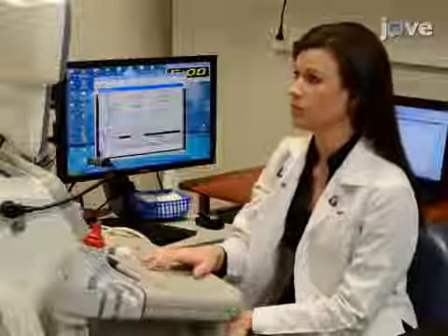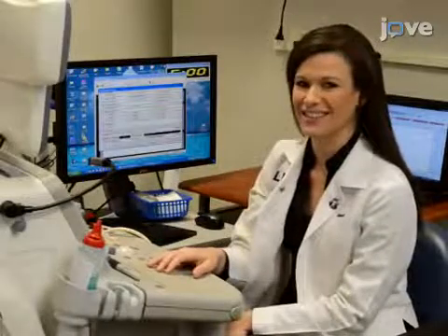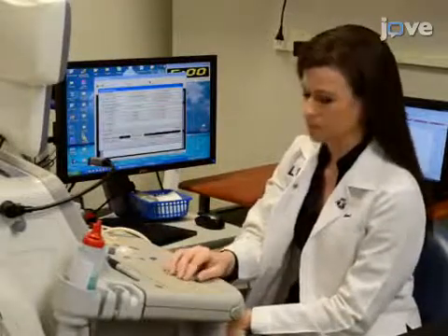Generally, individuals will struggle with this technique because they cannot obtain a good brachial artery image, requiring an adequate level of skill and practice for reliable results. Demonstrating the procedure will be Amy Mangieri, a registered cardiovascular sonographer in my laboratory.